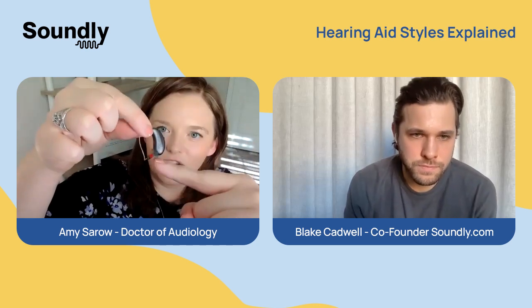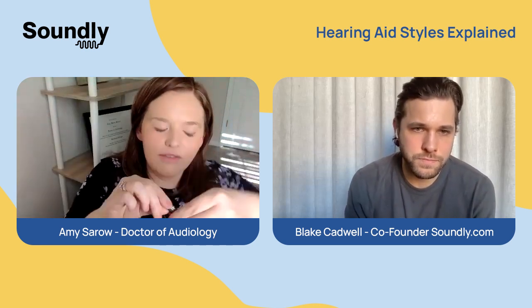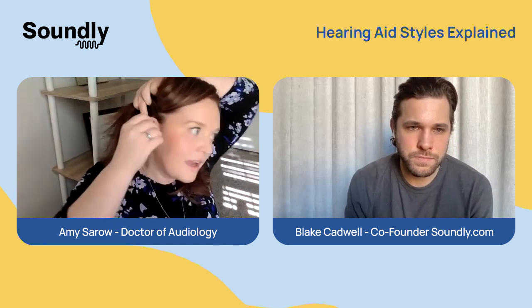So let's start with the most common hearing aid style, which sits behind the ear. And there are two big categories, BTE, which is a little bit higher powered, and then a receiver in canal. Maybe you can talk to us and potentially show us what a hearing aid that sits behind the ear looks like. So a lot of people like the behind the ear styles, whether it's a RIC or a BTE, because it is comfortable for most people. There's a wide fitting range. So if you have normal low frequency hearing, there's ways to fit that to keep it natural sounding. So we have the receiver here and this little piece that goes in the ear and this piece that goes behind the ear. So I'm just going to put this behind my ear.